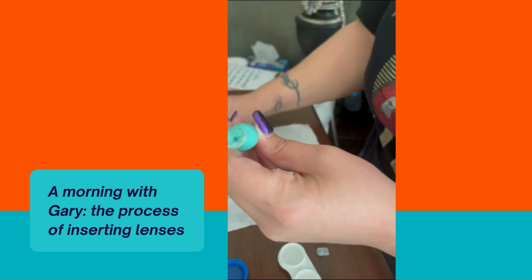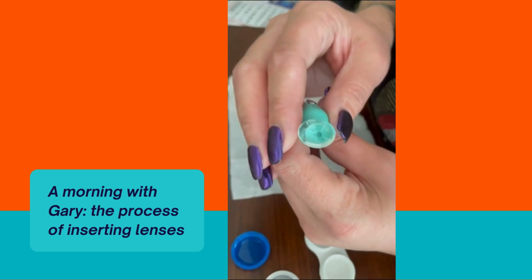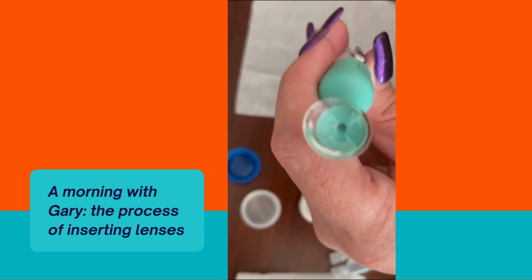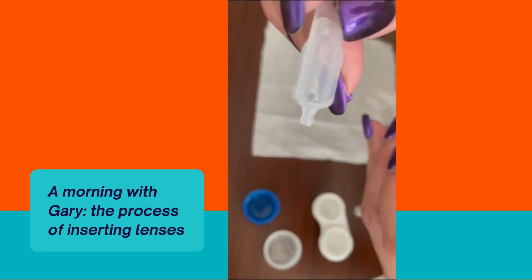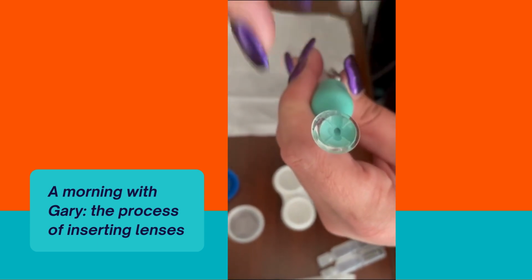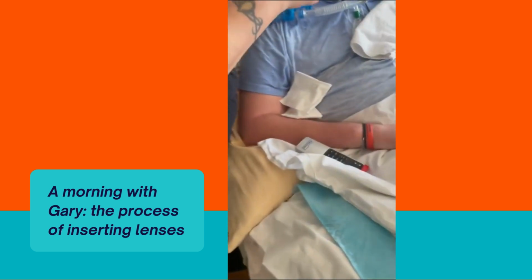Now, sometimes you can get a little bubble in there ahead of time, right, when you squeeze it out. Yes, you can. I was trying to get one in there, but I didn't. What you can do is take the empty container of the eye drops, squeeze it out so the bubble is coming, and sit it on top of the bubble and then let go, and it'll suck the bubble back in. Which sometimes is kind of easy. You can also just pop the bubble with the thing on the end.